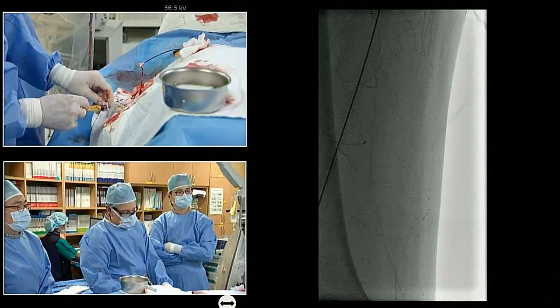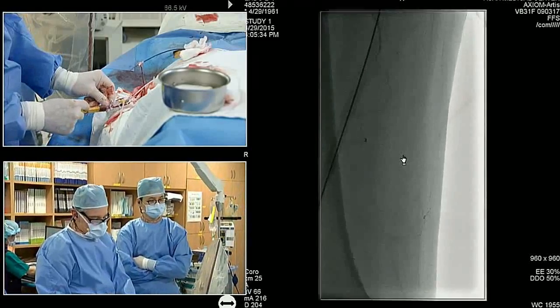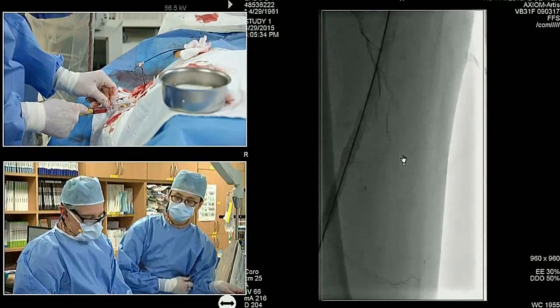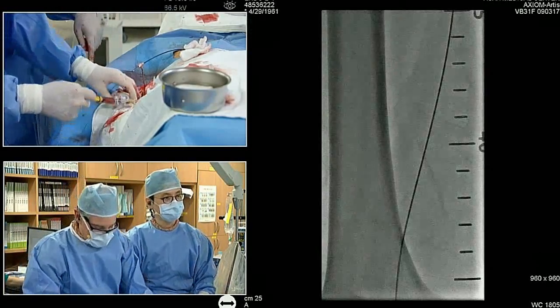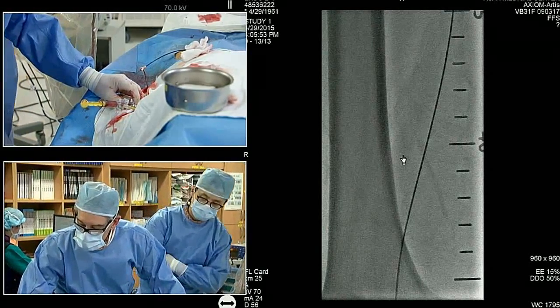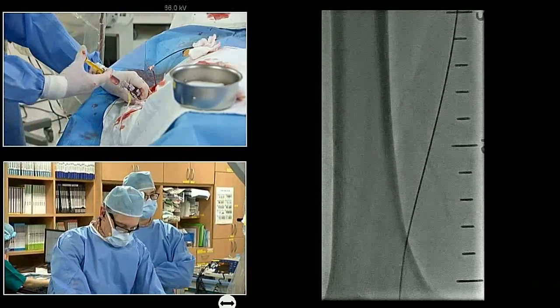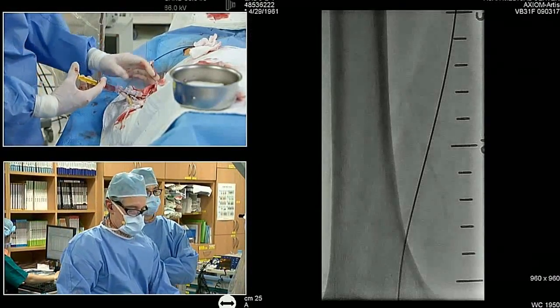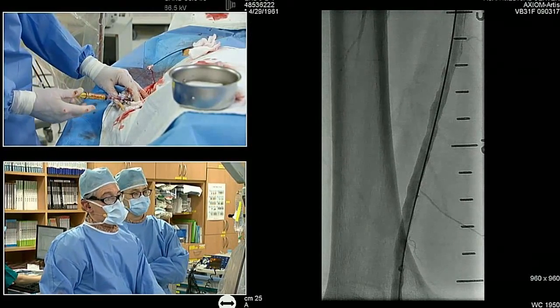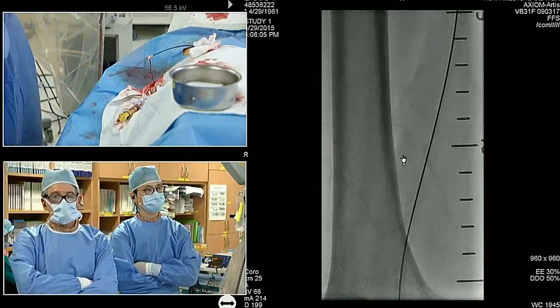Yeah, still looks great. You want one more of the distal? We'll get you one more of the distal. It went off the screen there. And let's, yeah, that's good there. And we can demagnify one. Okay, you don't have to pan. We'll just see it come down here. Looks pretty good. Great. Congratulations. I don't know, my vote would be that we're done.